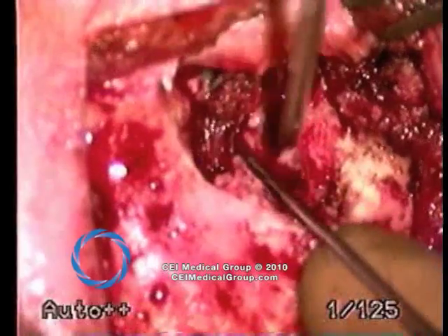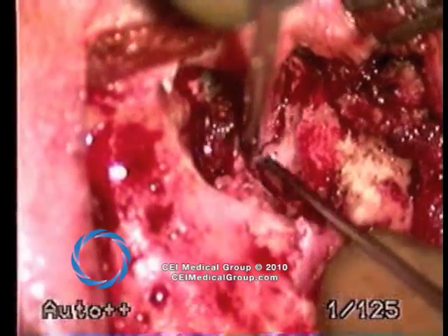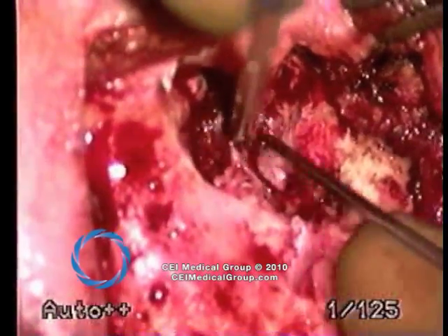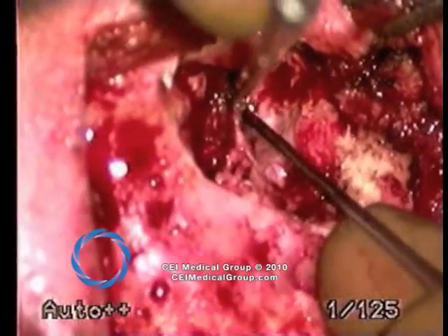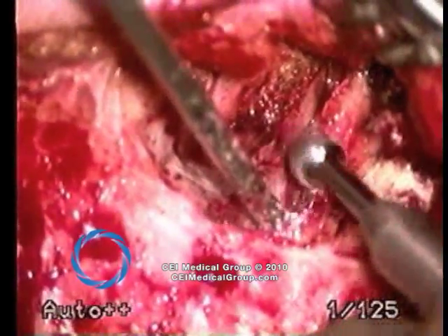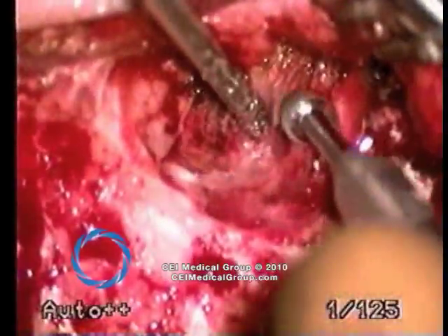Attempting to keep the skin intact, dissection proceeds along the margin of the lining of the bowl with the tegmen. The drill is used to remove a small lip of bone in order to expose all of the contents of the mastoid bowl.